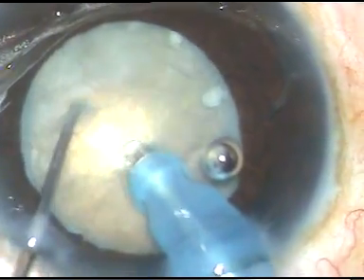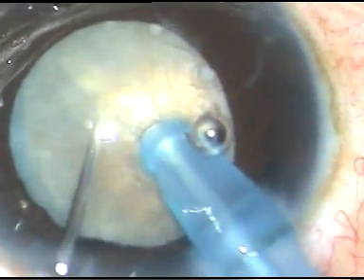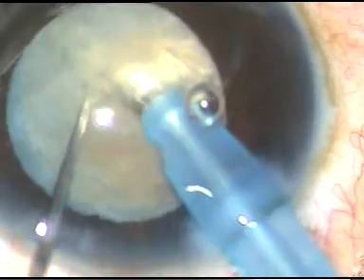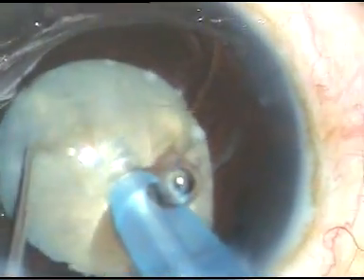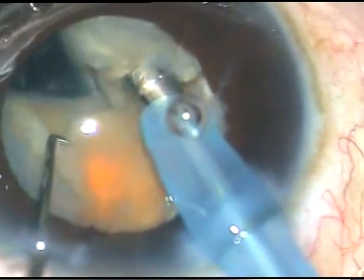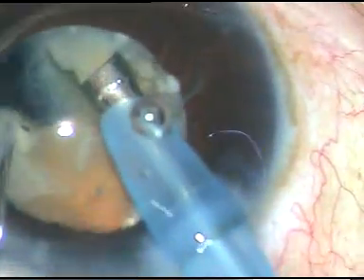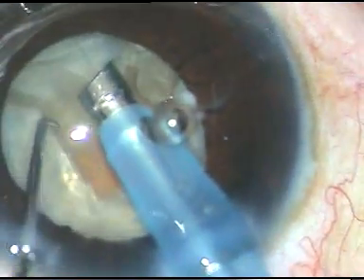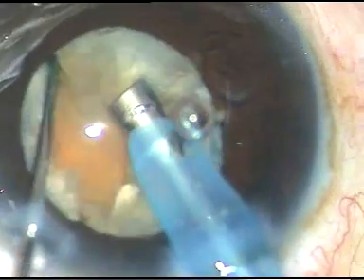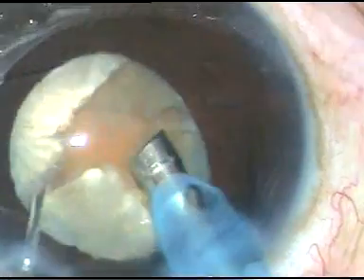Now, in hypermature cataracts, the epinucleus is usually incorporated into the nucleus, and everything is a solid mass. So I have to hold the nucleus with high vacuum. And here is the vertical chop — place the chopper in front of the phaco tip and crack. And after cracking, here you can see the endonucleus. This is a bit brownish.